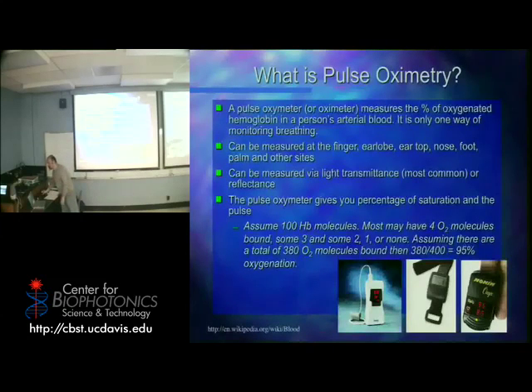So in the hospital, these devices look more like a box. And actually, if you're curious, I have pictures later on, because recently I had to make some visits to the hospital, not for myself, but for others, and I took pictures of all these things. They are bigger machines, and they come off with a wire and a little Band-Aid looking thing.